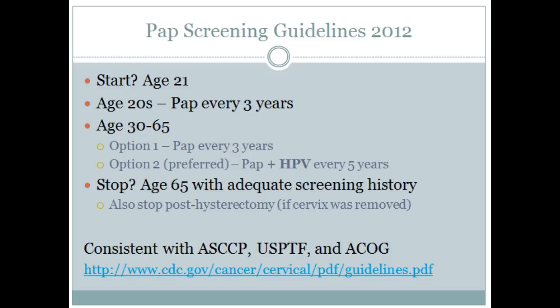So you could take perhaps the spatula and just scrape it across that line where the staples were, where you can see that it was pinched shut at the back of her vagina, and send that off for the pap, and you can see if there's abnormal cells there. Again, you're only doing that in the event that a woman had a hysterectomy because of cancer.